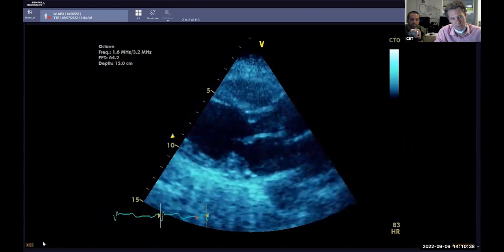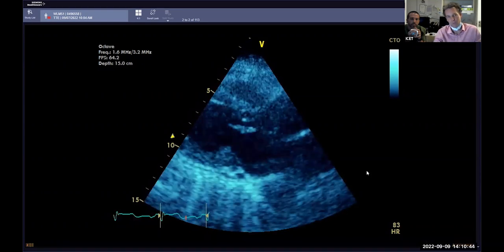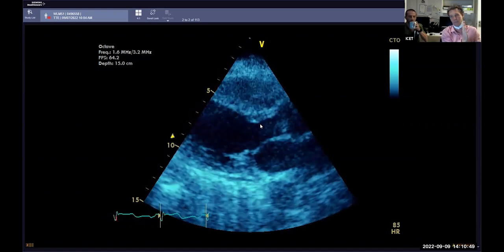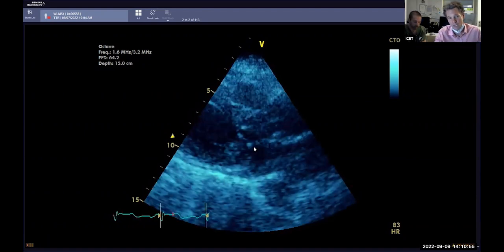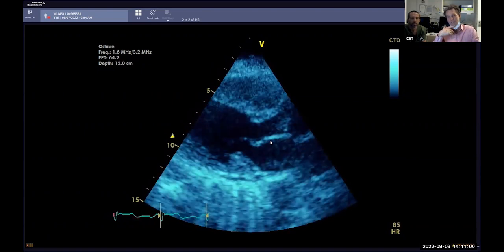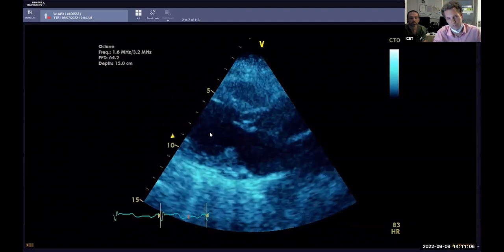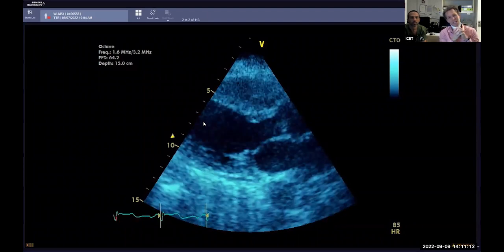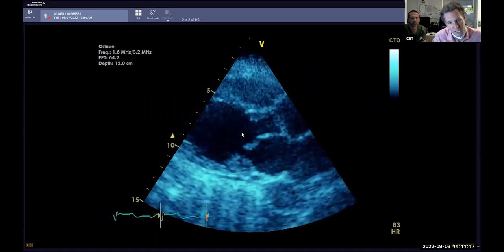The next thing to look at, and I'll just put it back up to full speed. The next thing that Ben's absolutely picked up beautifully is to worry, if you've got hypercontractile basal segments secondary to the akinetic mid and apical segments, about whether you're going to get some form of LVOT obstruction. So here we've got a really nice example of the anterior mitral valve leaflet being pulled into the LVOT during systole. And you get better with practice looking at it. The tip and trick I have is to look at where I put my cursor there, at that point in the left ventricle chamber, and then use your peripheral vision to look into the LVOT.